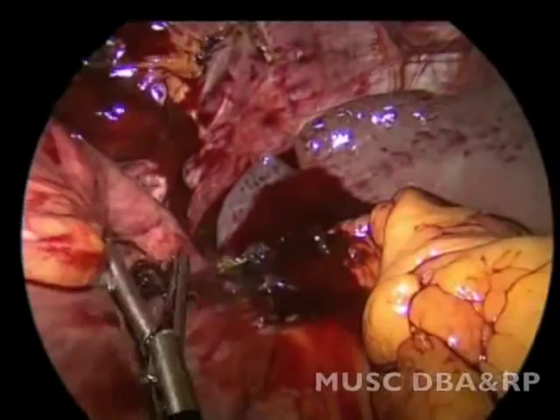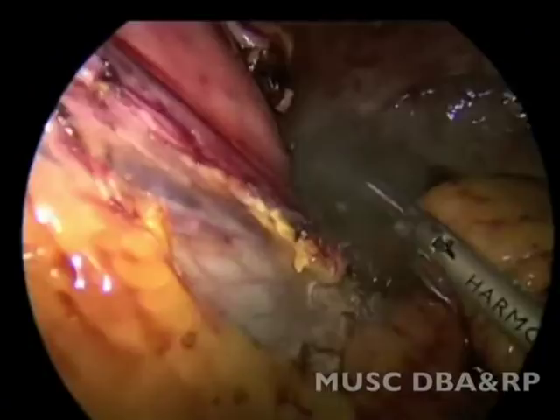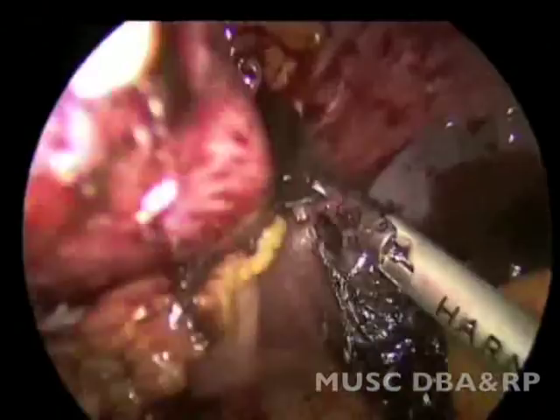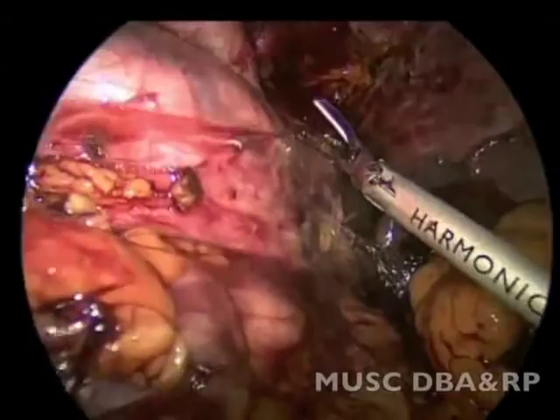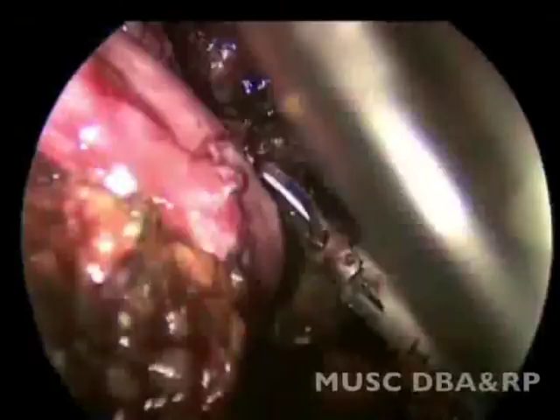The posterior short gastric vessels are taken down. Not taking these initially could have added to the torque on the gastroesophageal junction, contributing to the dysphagia. The left crus is now visualized and the fundus is mobilized off the left crus.